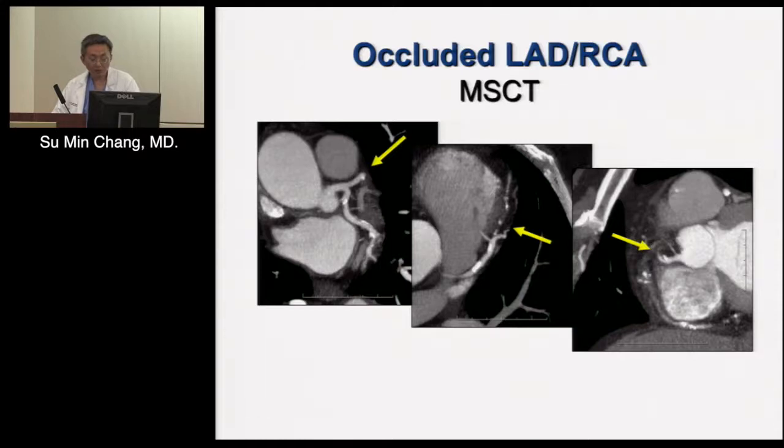But for diagnostic purposes, even if you can't make an accurate assessment of stenosis in all three coronaries in each segment, for your management purposes, as long as you see a vessel with significant stenosis and the patient has symptoms, basically that's the role of CT.